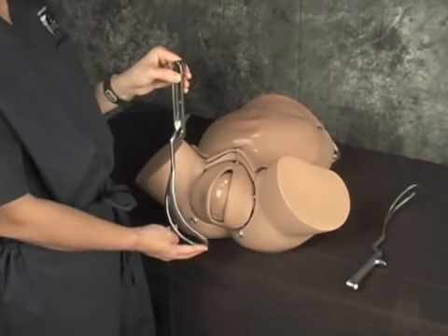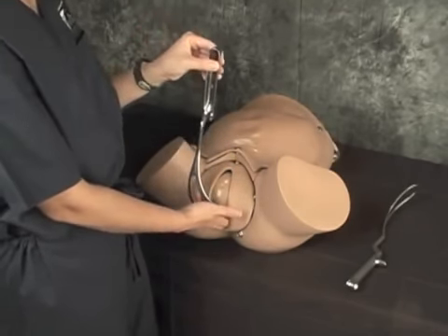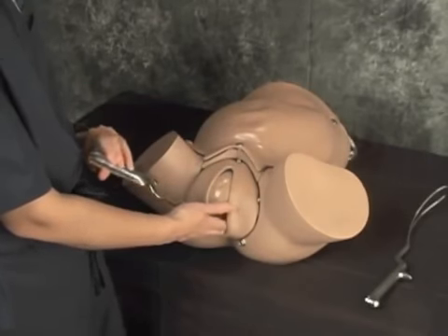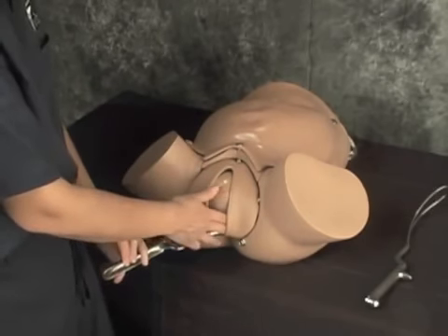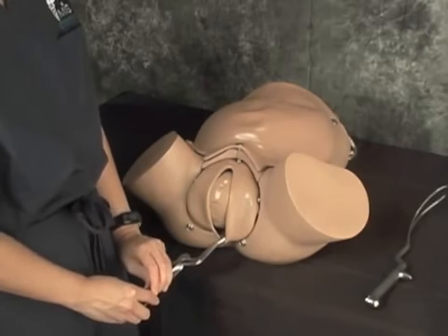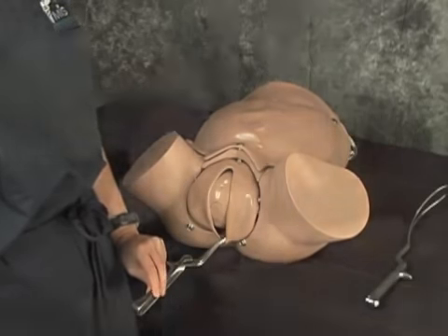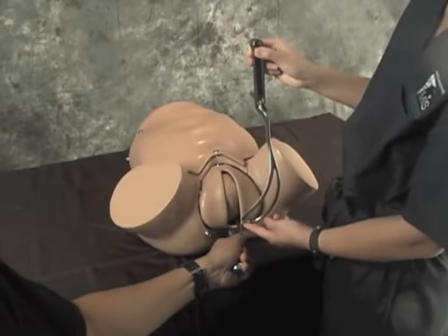With your back towards the patient's right knee, insert your middle and index fingers inside the vagina and gently insert the left blade posteriorly in a vertical position. Arc the left forceps handle toward the patient's right thigh, then bring the handle towards the midline. You can ask an assistant to hold the left handle in place.